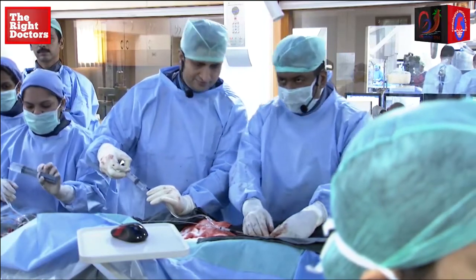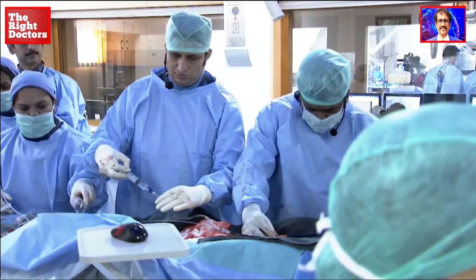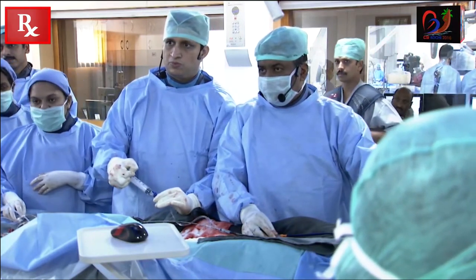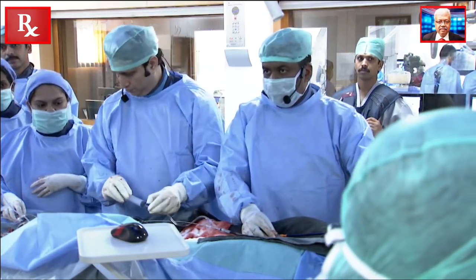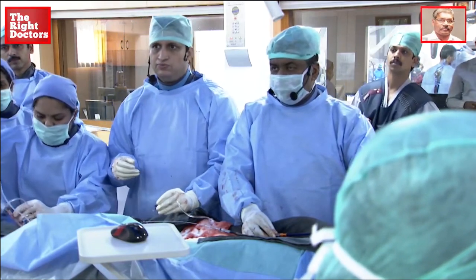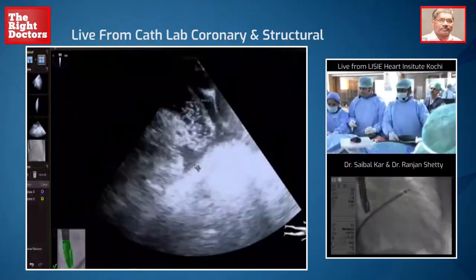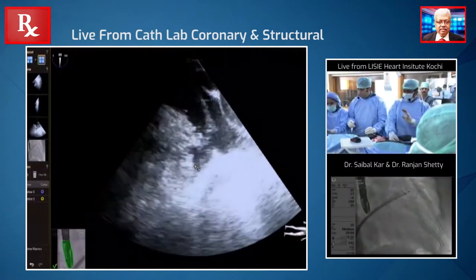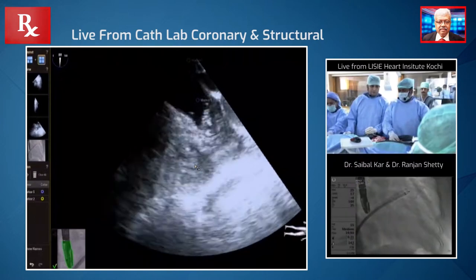Okay, great. So we managed to put the sheath into the atrial appendage. We mentioned about twenty — we've taken a twenty-four device and we've placed it at the tip of the appendage, but it's a very risky position, so I just have to be careful.